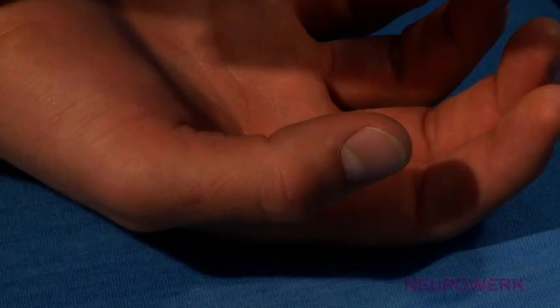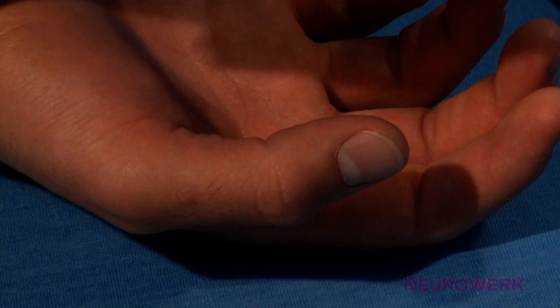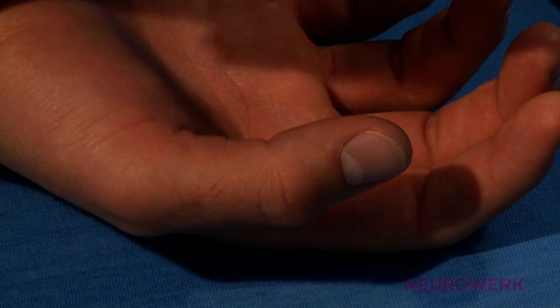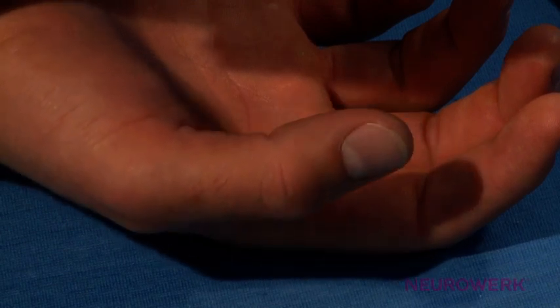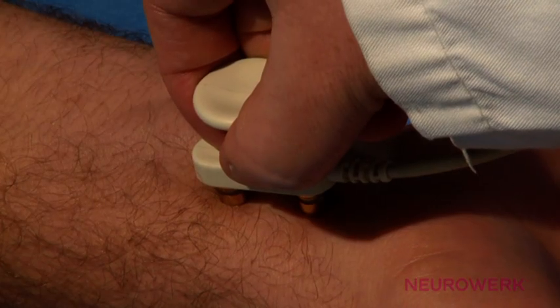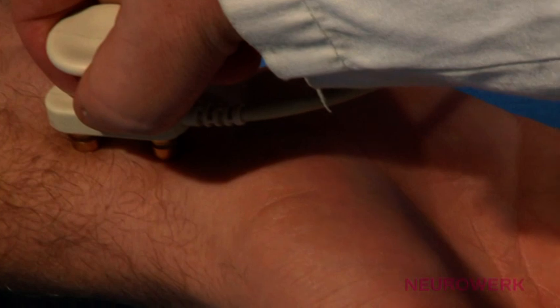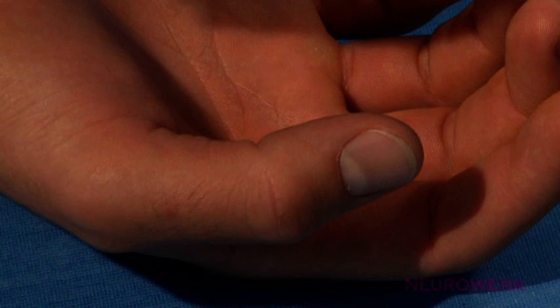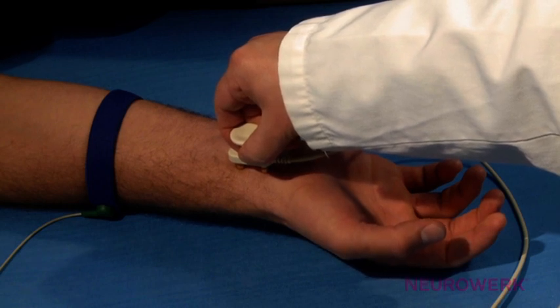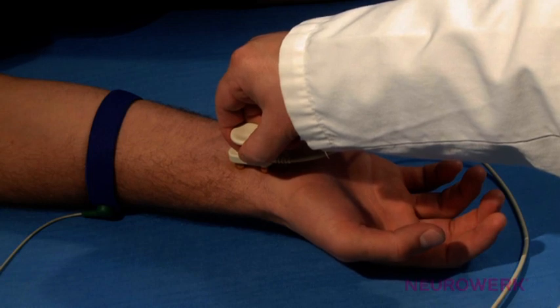The stimulation starts with low stimulation intensity and increases slowly while the stimuli are triggered cyclically. It is stimulated for as long as a motor response can be seen on the thumb muscles. This will result in the stimulation intensity becoming increased by a further 3 to 4 mA. If due to a disease the motor response fails to appear, the sensory threshold, the intensity when the patient senses the stimulation for the first time, should be ascertained. In this case, it is necessary to stimulate with the triple sensory threshold.